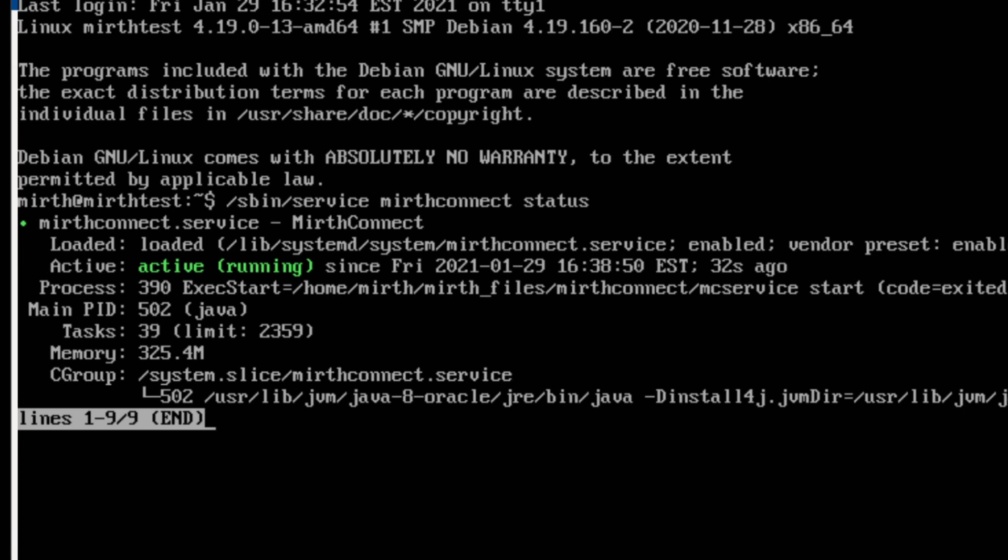And from here on out, if everything stays the same and you don't change any of the folder names or locations of the stuff, this will continue to execute when the system starts.